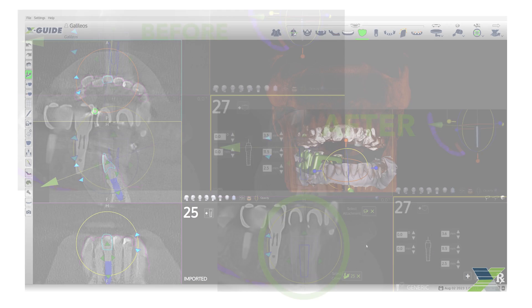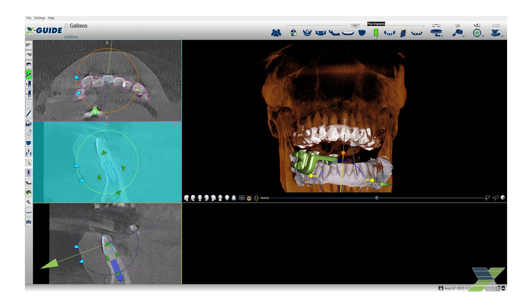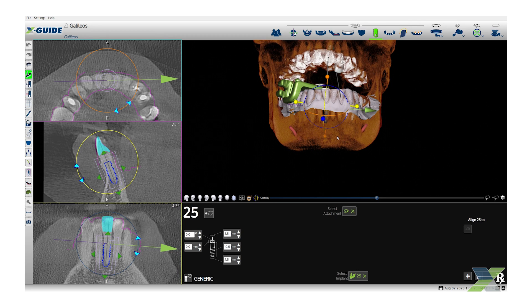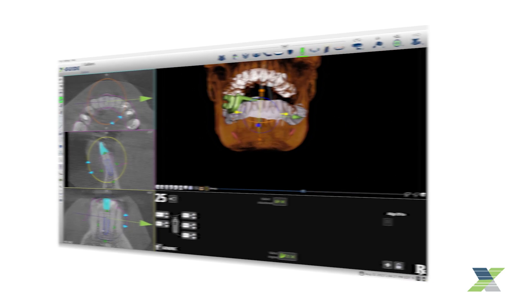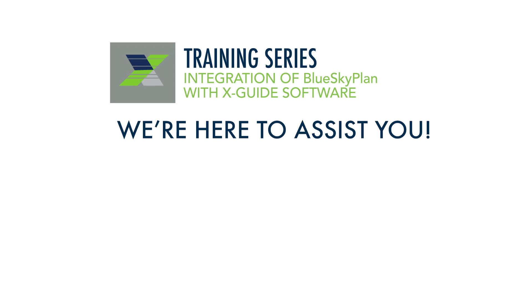Now that you have successfully imported your Blue Sky Plan case, you are ready for XGUIDE instrument calibrations and navigation. If you have any questions, please feel free to contact Technical Support.